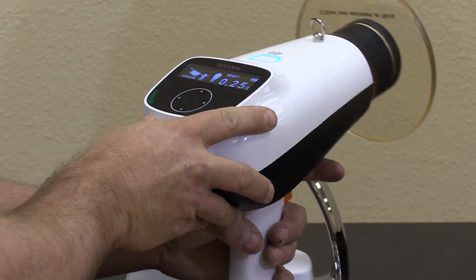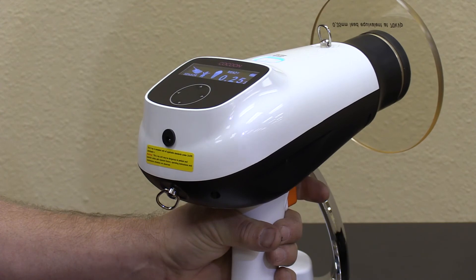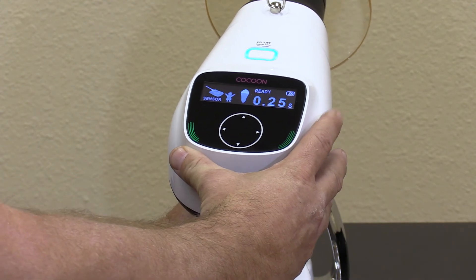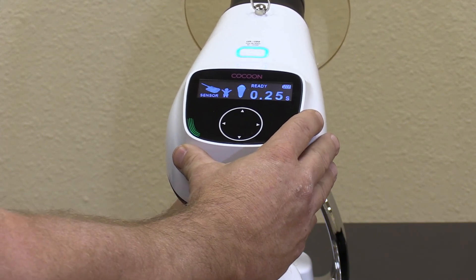Once you have that set, simply pull the trigger. The tube is energized and ready for exposure, and it lets you know the tube is ready to re-fire. This unit also features a handy talking feature that you can turn on or off, which will also instruct you on taking x-rays.